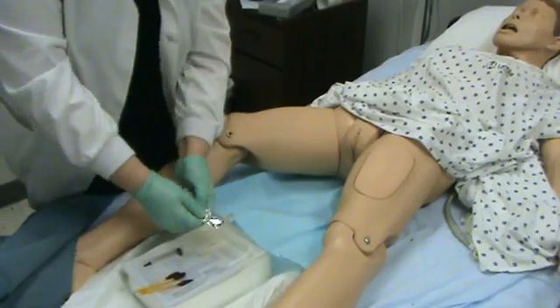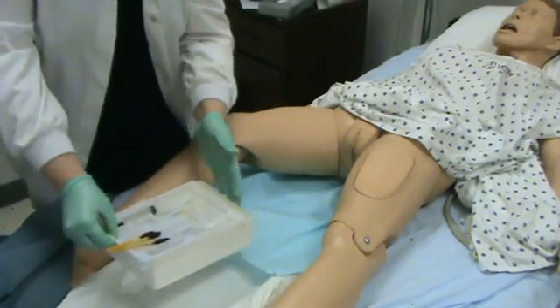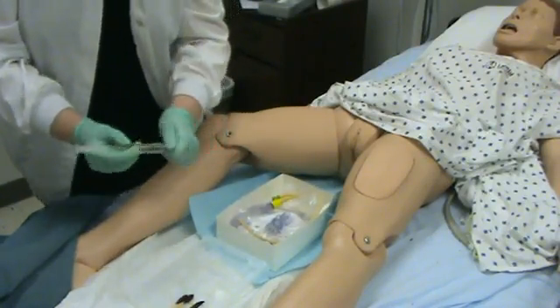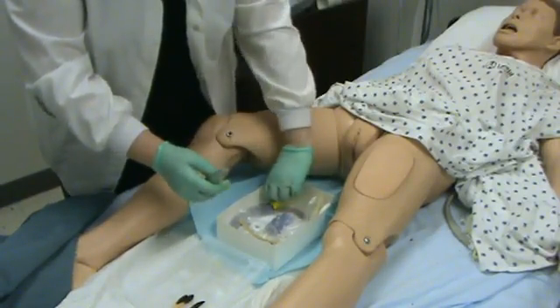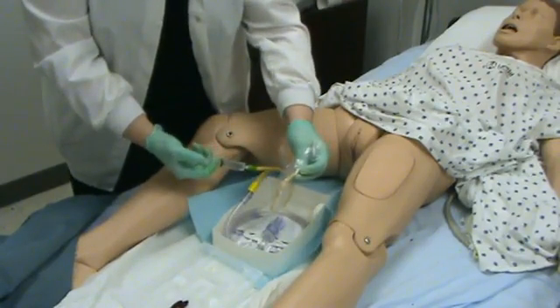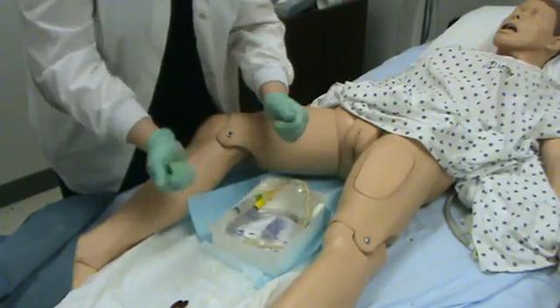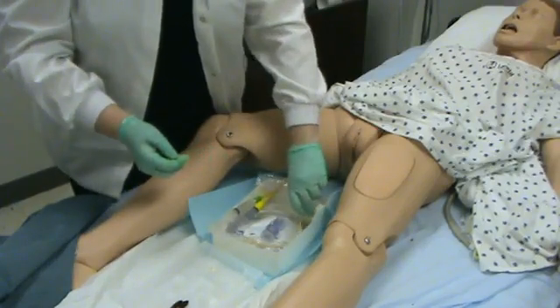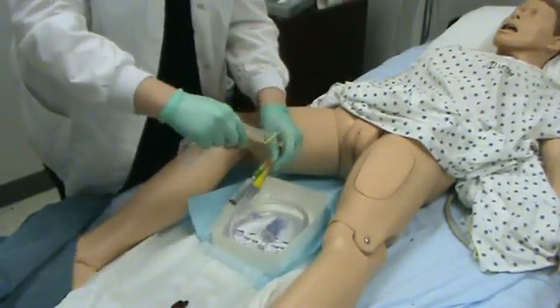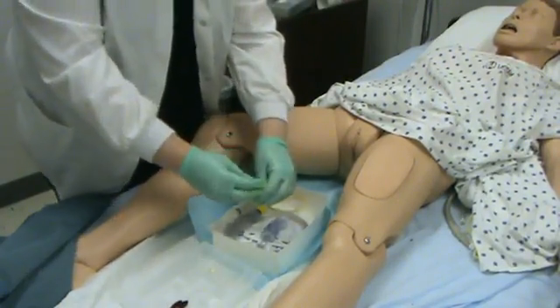I need some lubrication for my Foley cath. I am now going to separate my box from my catheter. I want to test my balloon — I am going to make sure that the balloon inflates and that it is intact. Some catheters, the manufacturer does not recommend doing this, so please watch what the catheter maker has said. Here is my sterile specimen container. Once I have checked my balloon, I am going to remove the plastic wrap but make sure that you have control of your Foley catheter so that it does not become contaminated.